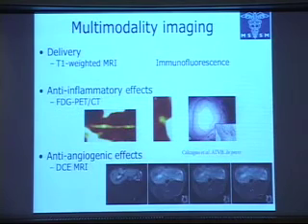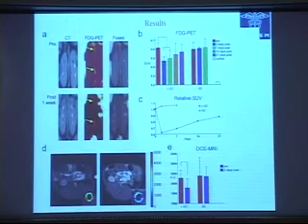Using the same tools that I explained before, again a multimodality approach, Willem has shown, both by FDG PET and by dynamic contrast enhanced MRI, as well as by labeling the liposome with gadolinium, that he can see the delivery occurring in there. People who are doing interventional MR imaging and other work know that it's important to monitor whatever you inject, and use the imaging to help you, not only to read the effect, but also to understand the delivery better.